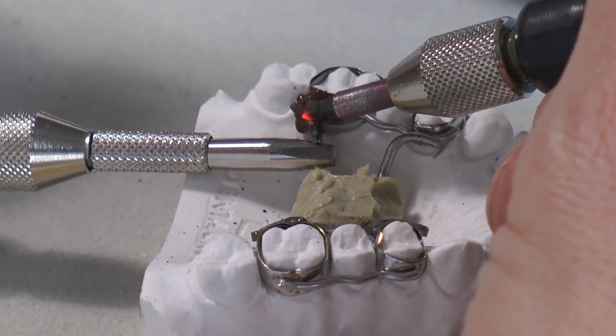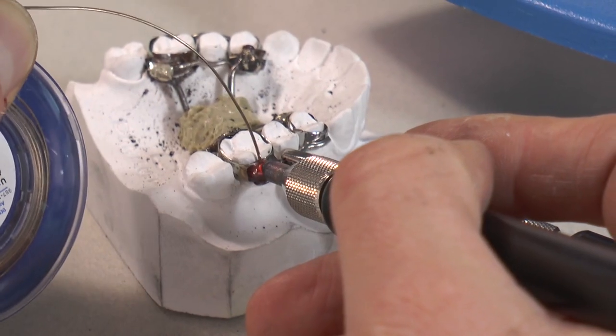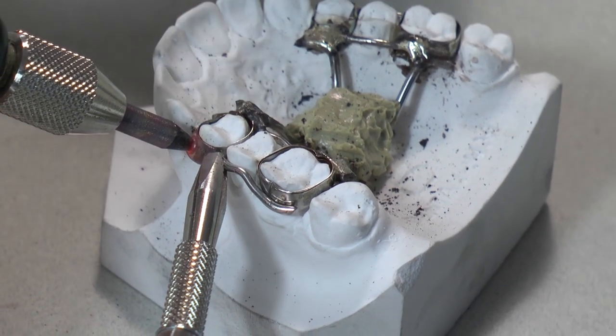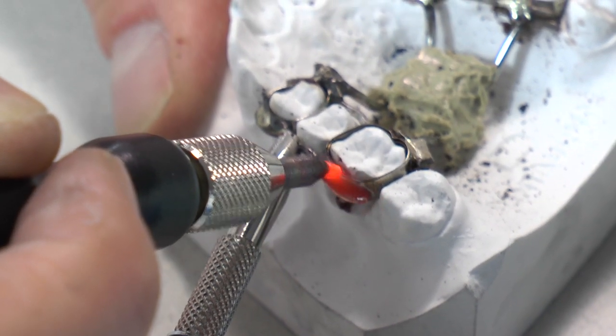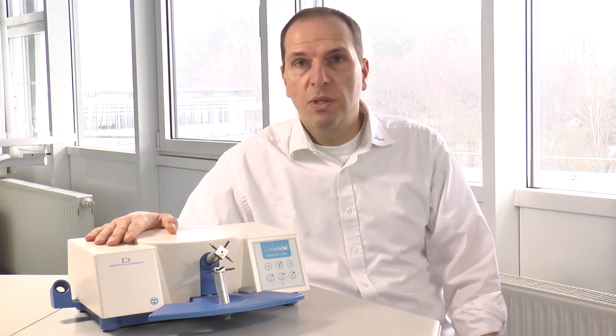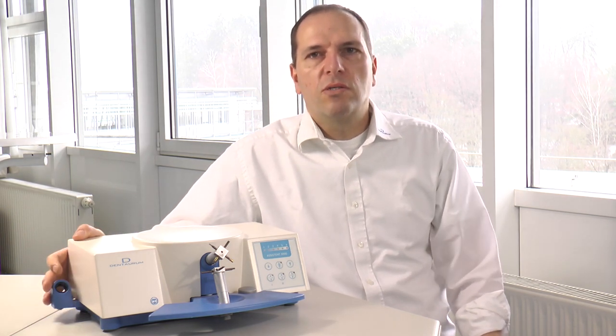Of course all solder work I showed you needs the usual finishing. Now that was the main use of the unit. Other functions you can find in the instruction for use. If you work with the unit, please follow the instruction for use — it comes with every unit, or you can find it on our website at www.dentaurum.com.